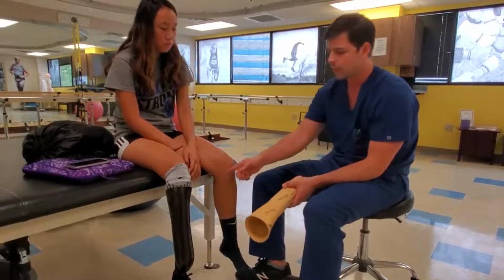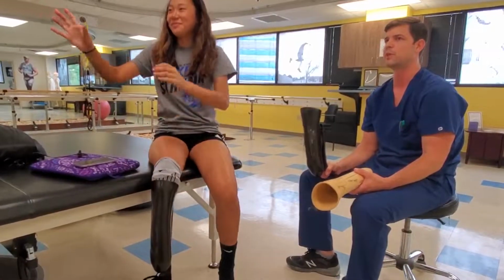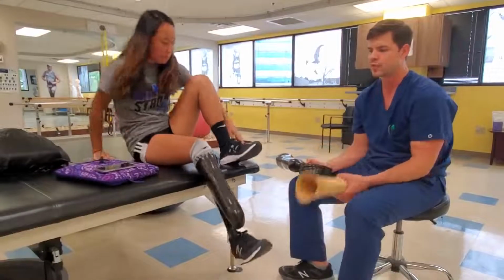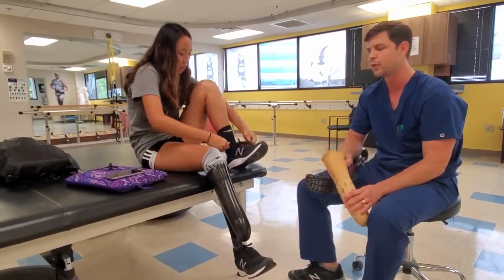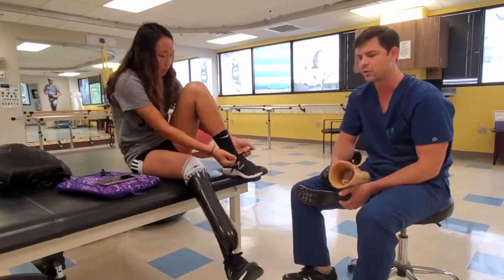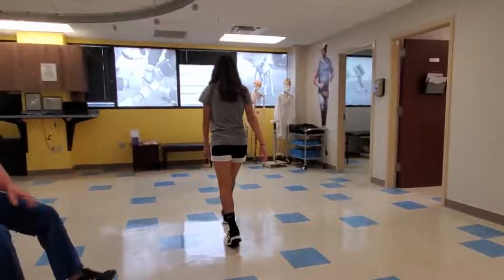So we'll put Katie's other shoe on, and then she'll just go for a walk and maybe do a couple lateral shuffles to show off the movement. And if all goes well, we'll be good for another year. We anticipate changes as they continue to grow until they meet skeletal maturity. So changing out sockets as they grow is pretty normal. I'm pleased that this foot has lasted this long, and so not much going on here besides normal growth. That's why she's down in Tennessee for this week.